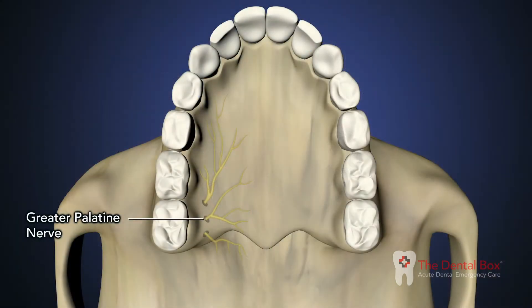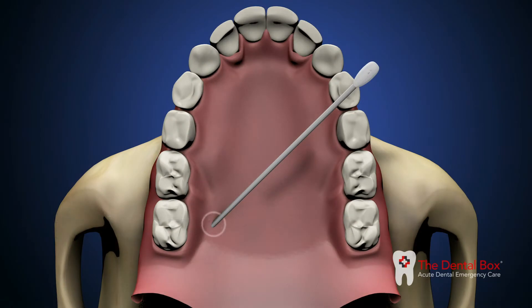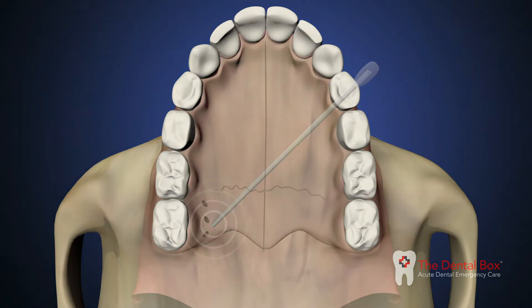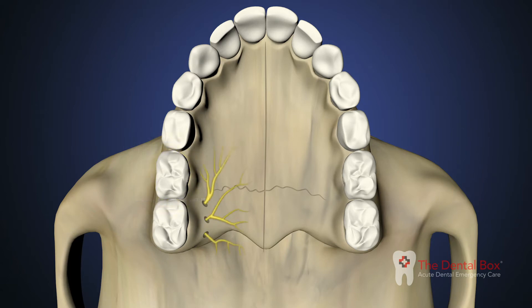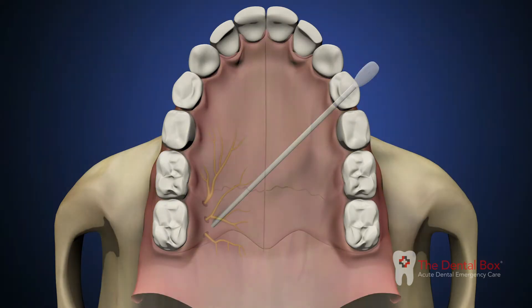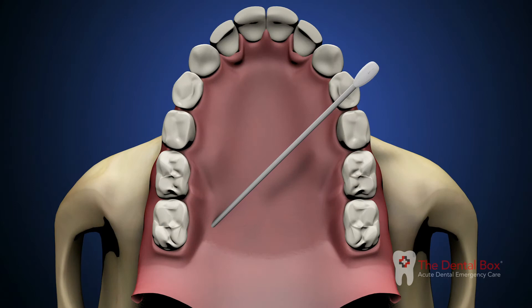Place a cotton swab and apply moderate pressure at the greater palatine foramen, which is located just distal of the second maxillary molar where the teeth transition to the roof of the palate. You will note the blanching of the soft tissue with the pressure applied by the cotton swab.